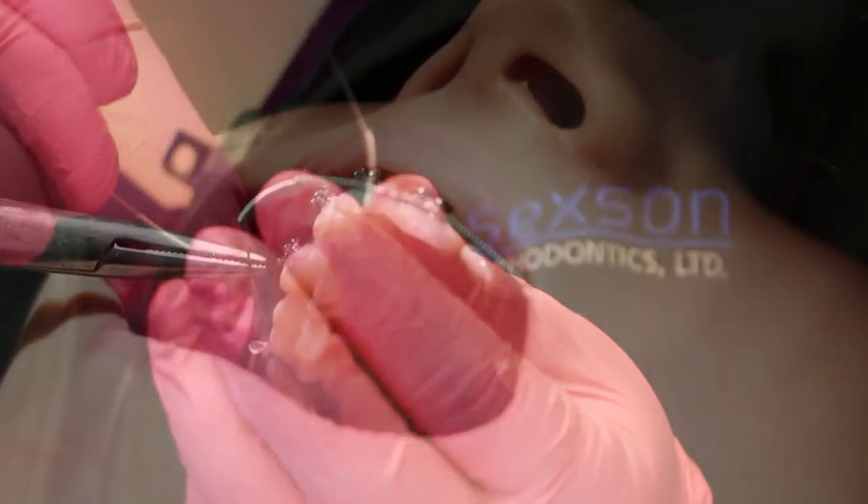At that point, we can take the retractors out and give you a little freedom. The assistants place wires into the braces, which will actually move the teeth around and get them straightened out.